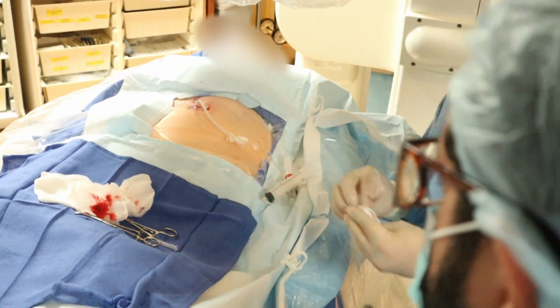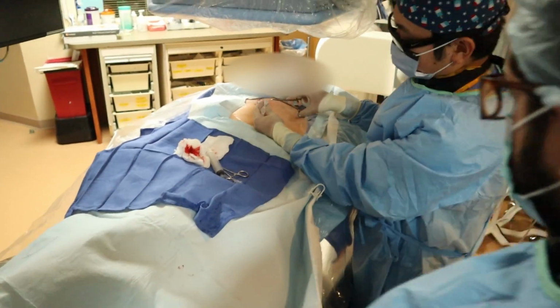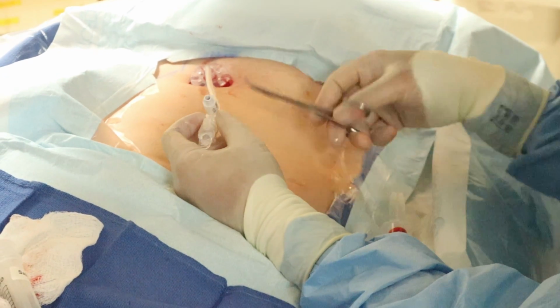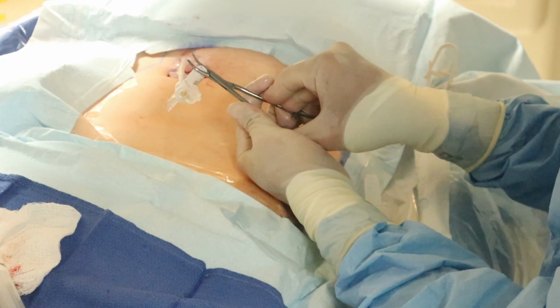And then we're going to leave this to gravity for 4 hours. So one thing I like to do is, the MIC tube has this balloon port which is easily mistaken for a flushing port. So they accidentally inject some contrast or saline and then the balloon bursts. So I crush this so that no one can access this.